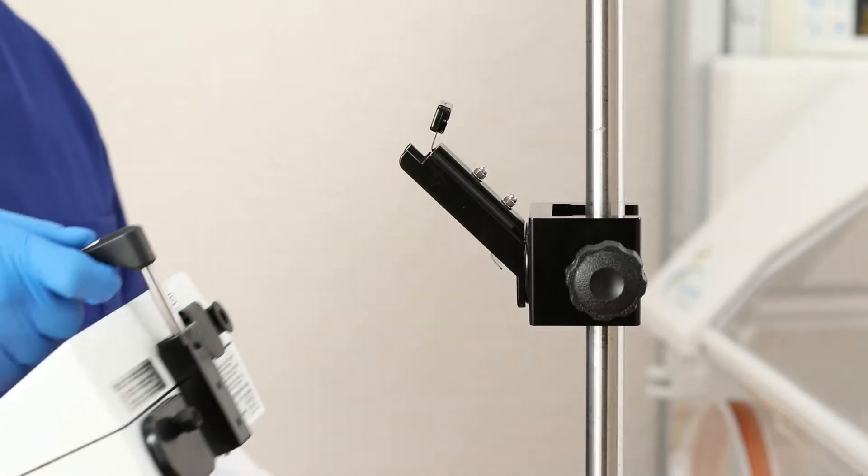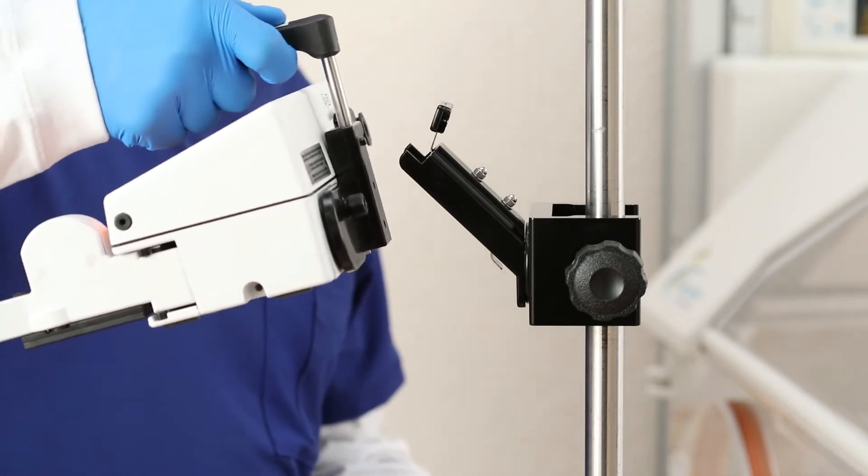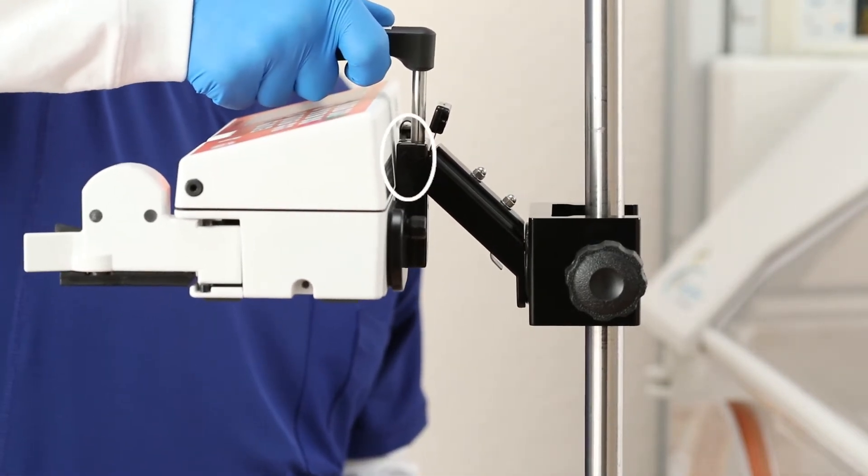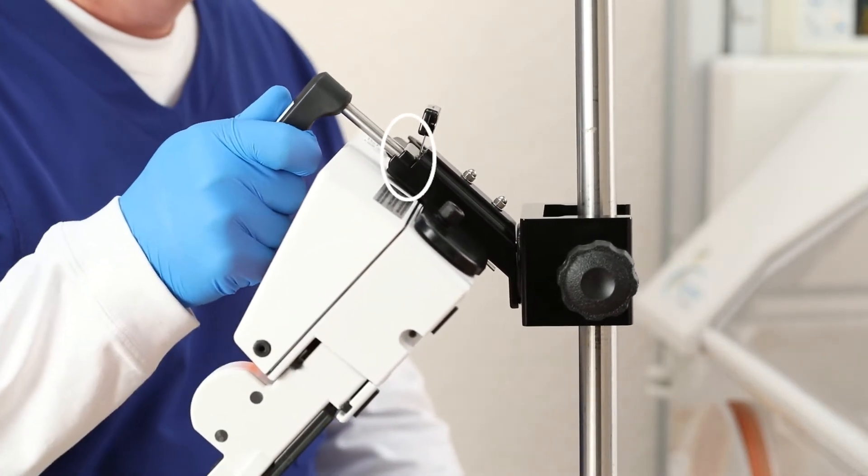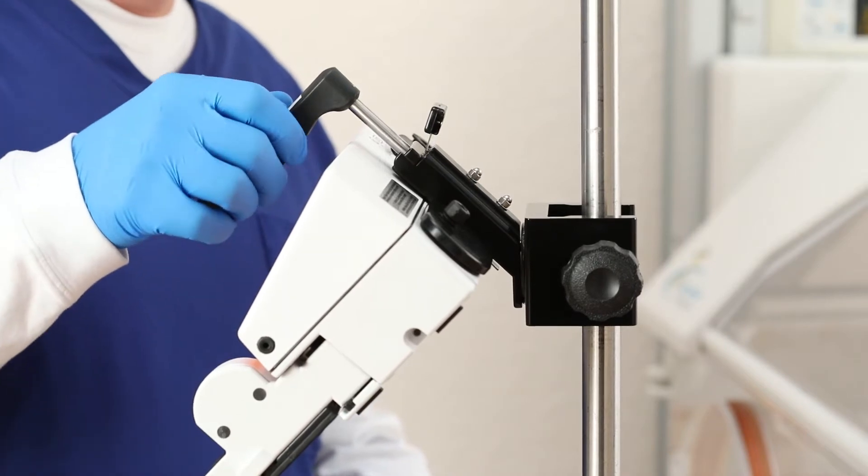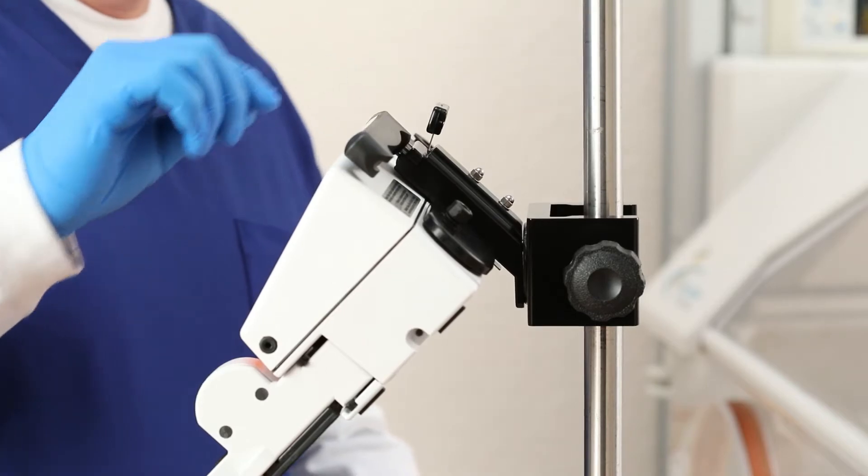The second step is to mount the pump to the pole clamp. To mount the pump to the clamp receptacle, ensure you are using the pump handle. Align the locking tabs at a 90 degree angle into position and gently push down on the handle of the pump until it locks into position. You will hear a clicking sound to ensure it is secure. Return the handle to the store position.